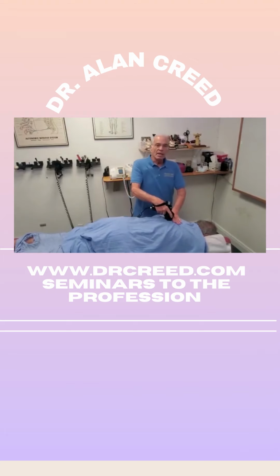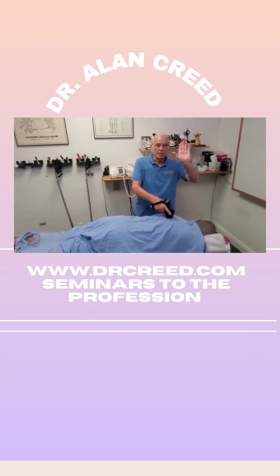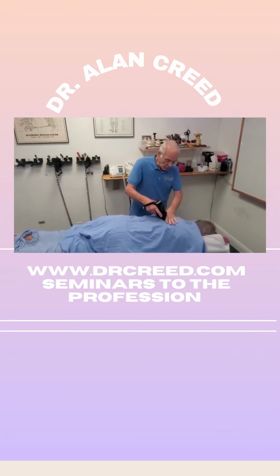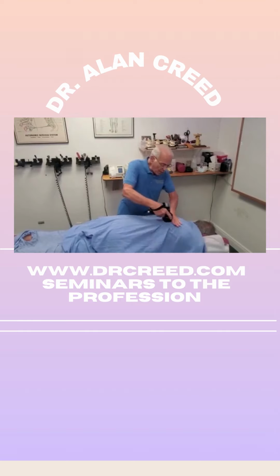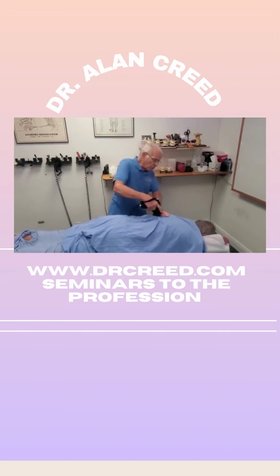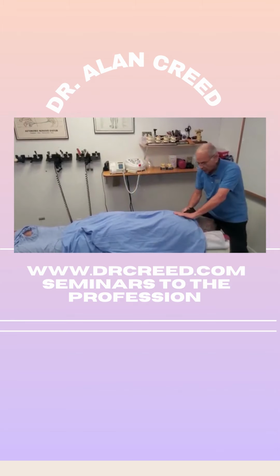Why? Because if you go real high, the body's going to start to push against it. Remember, the proprioceptors are telling your body what to do. So if the muscle is being compressed, it's going to start to fire up. So right now we're using this at a medium level, and we're flushing the muscle group out. We're flushing it out, and we're getting into this area right here with the neck and shoulders.